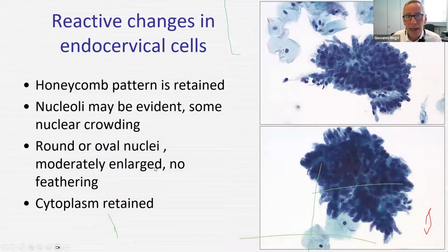So no problem in that case, but actually your main differential diagnosis is going to be with reactive changes in endocervical cells. And mostly in reactive changes, you have a higher cellularity and some nuclear crowding, for example, in that case.